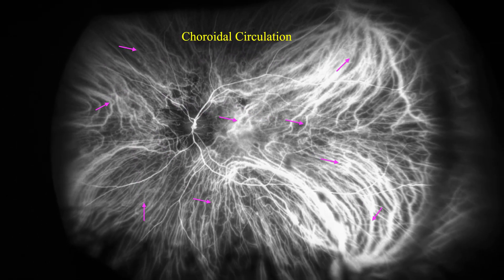On the other hand, the choroidal circulation is much greater. As you can see in the image, the choroid has a large number of blood vessels.